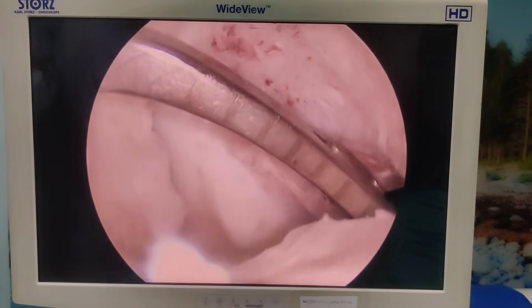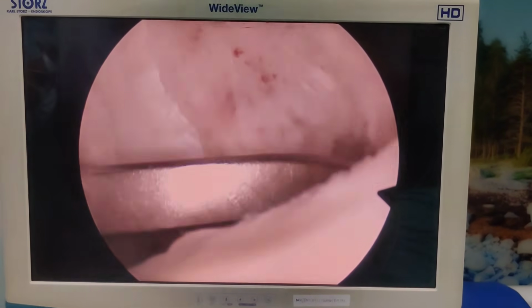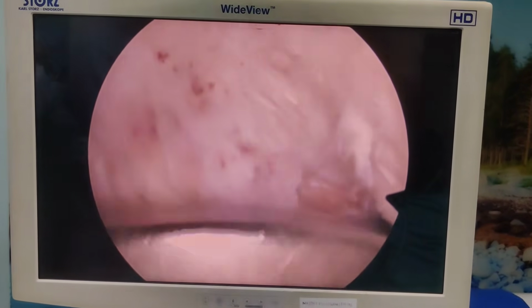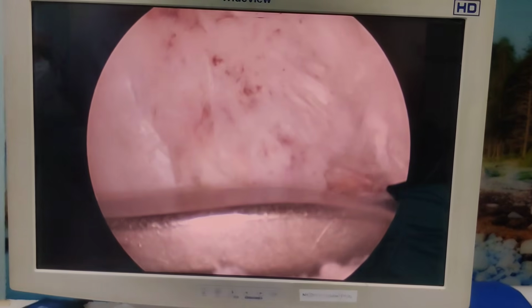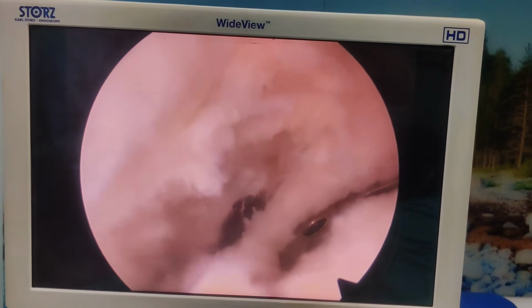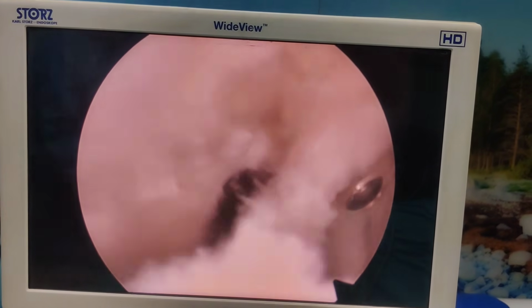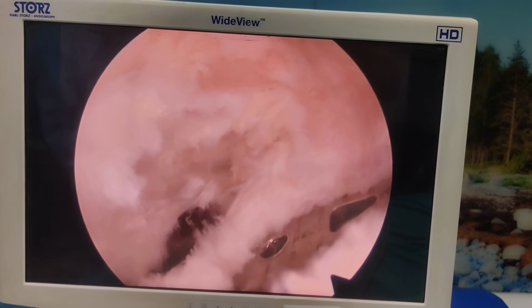So this is the tibial jig gone. If you can see, if you make it horizontal, it is right in the back. Now it's very hard to show it from here. Let me try to put my camera in the posterior medial portal and see if I can show you from the back. So now you can see that we are quite down. I have cleared it quite low down. This is confirmation because my camera is now in the posterior medial portal.